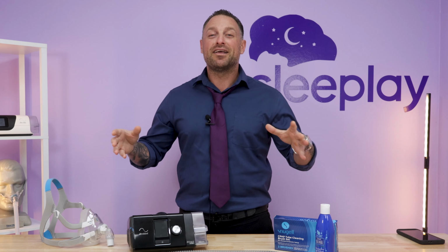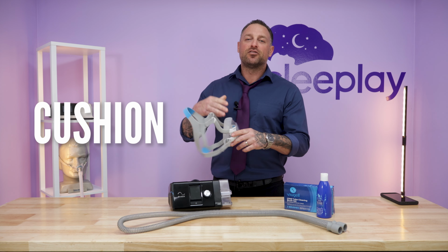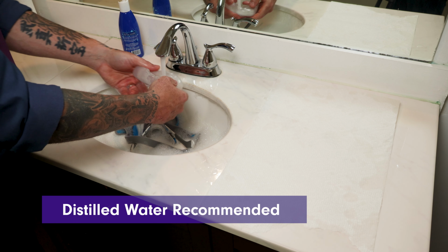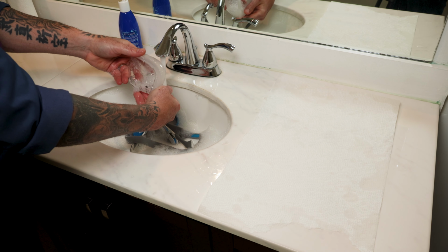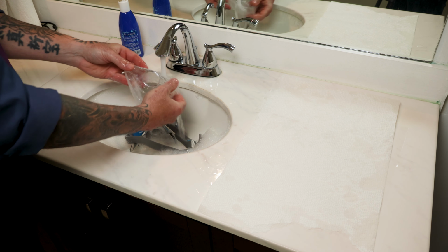So once you have the place and the products you're going to be cleaning, let's go ahead and start the cleaning process. Specifically the cushion, this is what you're going to wipe down or clean every day. Now if you're going to clean it, you want to clean it in warm soapy water. If you're going to do it that way, you want to take off the cushion from the frame every day, clean it in the warm soapy water as I said previously, and you can set it on top of that towel to let it air dry.